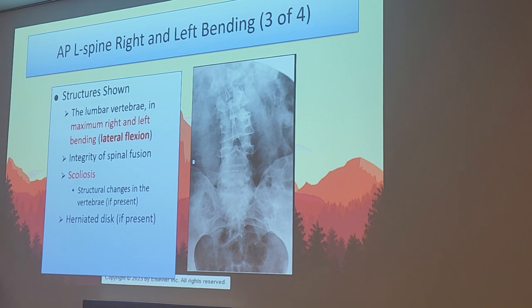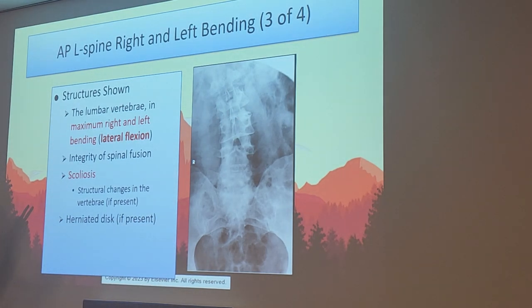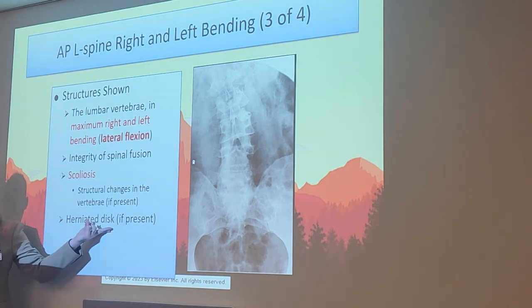So this is a right and left bending view. This type of movement is what we call a lateral flexion, but it's not the actual flexion L-spine x-ray. That's a different one we're going to talk about when we bend the patient forward and back. Keep that in mind. We're going to be checking the integrity of a spinal fusion, if they've had a spinal fusion take place, and scoliosis to see if there's any structural changes in those vertebrae. If they see something very odd with the degree of scoliosis, that's where you would see them ordering a view like this. Also, if there's a herniated disc, you can check for that as well.